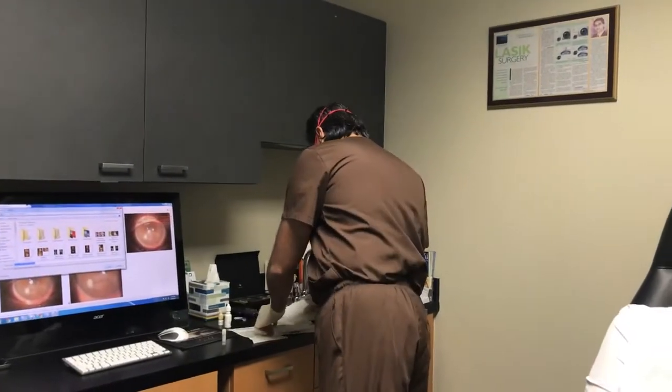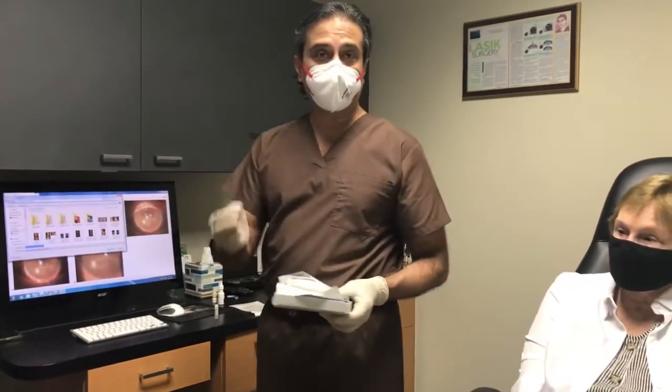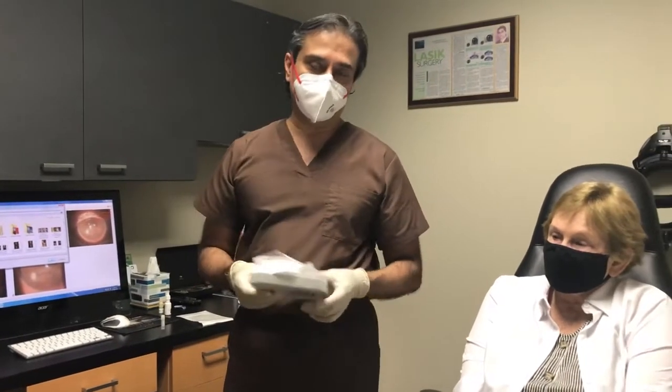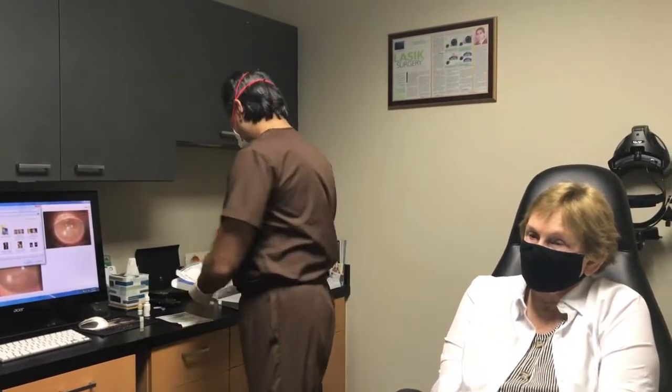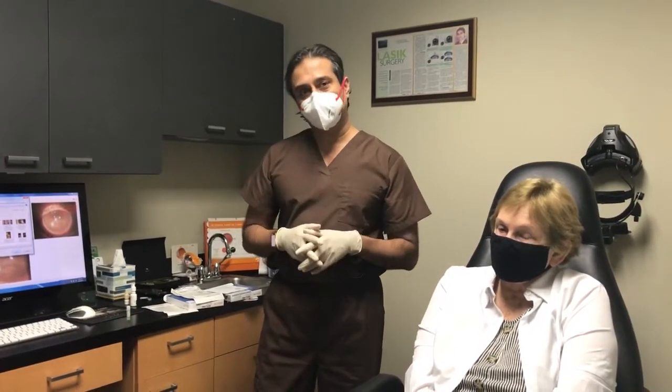Before we do that, we're going to put some of the Vision Restore amniotic tissue fluid directly in her eye to help rejuvenate her cornea and help her under the contact lens, and also twice a day for a week.